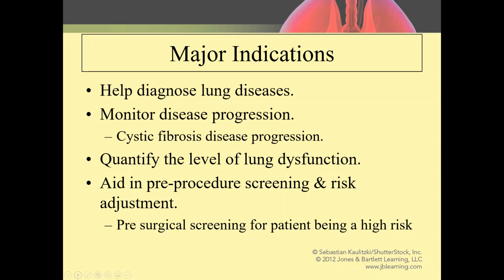So one of the things they do, not just for cardiac surgery patients, but focusing on them for a moment, is that before their surgery, they will do spirometry. We actually have a portable device where you're doing basically a forced vital capacity, and from that you're extracting different measurements, including a flow volume loop and the concomitant measurements. What they're seeking to do is at least two things. Number one is to ensure that the candidate's lung function is not so poor that they should be excluded because they're too high a risk for the surgery.